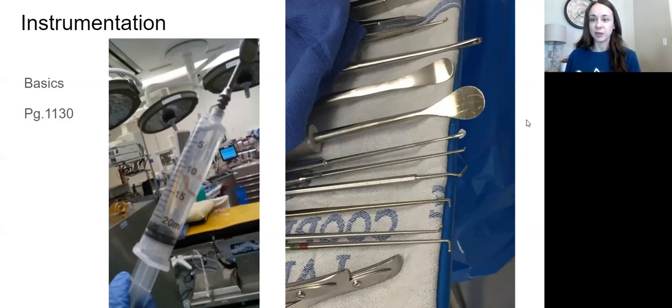So even if you see lots of bleeding happening on the microscope screen and the surgeon is yelling, "Give me that clip," you need to calmly and steadily load that clip, because I promise you, the calmer you are, the faster it'll be for you to load it and hand it over.